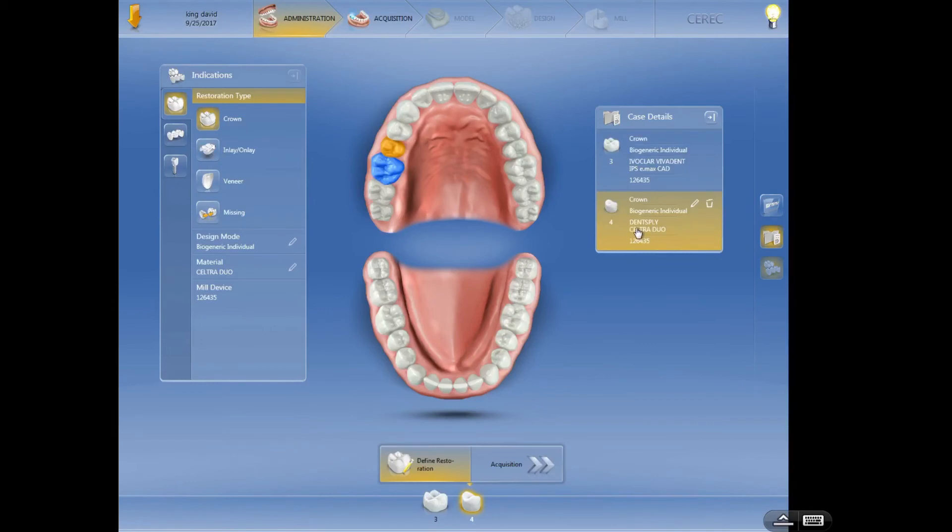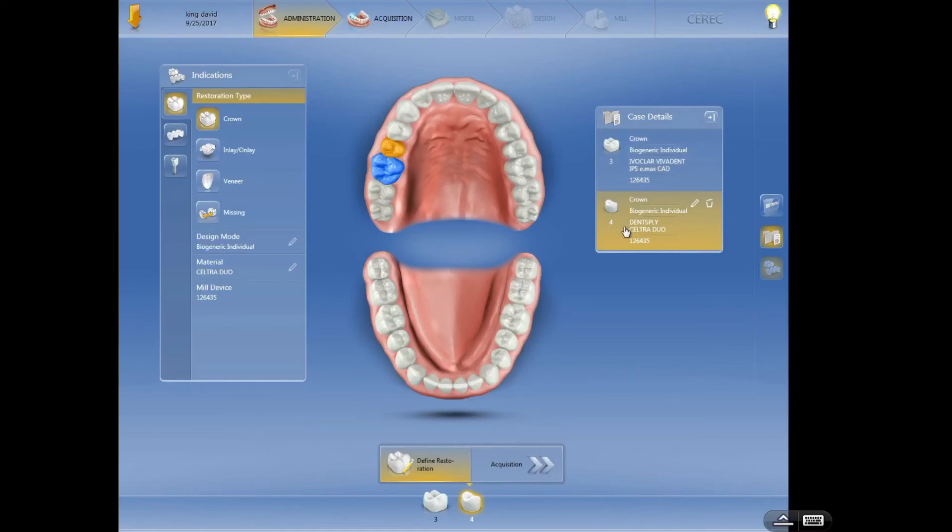You have all these selected already, just go through and click there, it is back again. But realize that it's going to be populating the type of material from your choices over here. So let's just say this is correct, this is exactly what we want to use, an Emacs on number three and a Celtra on number four. Once we double check to make sure that our case is correct, we're going to hit the next step and go to acquisition.